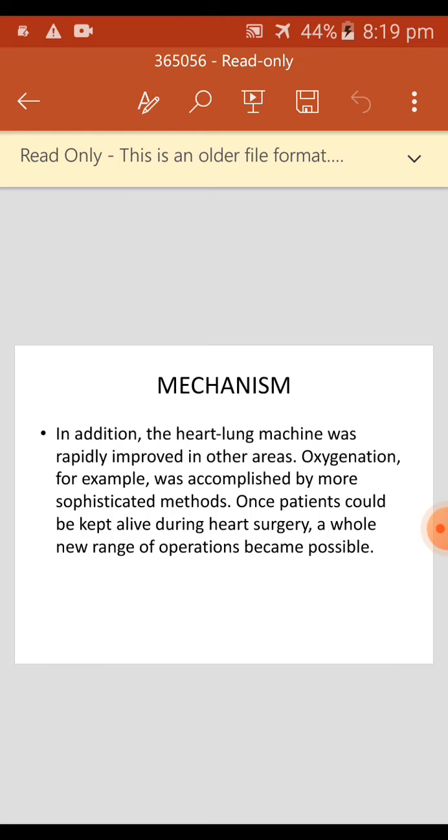The oxygen feed system permits use of a disc diameter close to the diameter of the oxygenator cylinder so that, for a given blood priming volume, maximum utilization of the available surface area is made. The optimum blood level in the oxygenator that provides the maximum film area for a given volume is 0.7 of the radius of the disc.